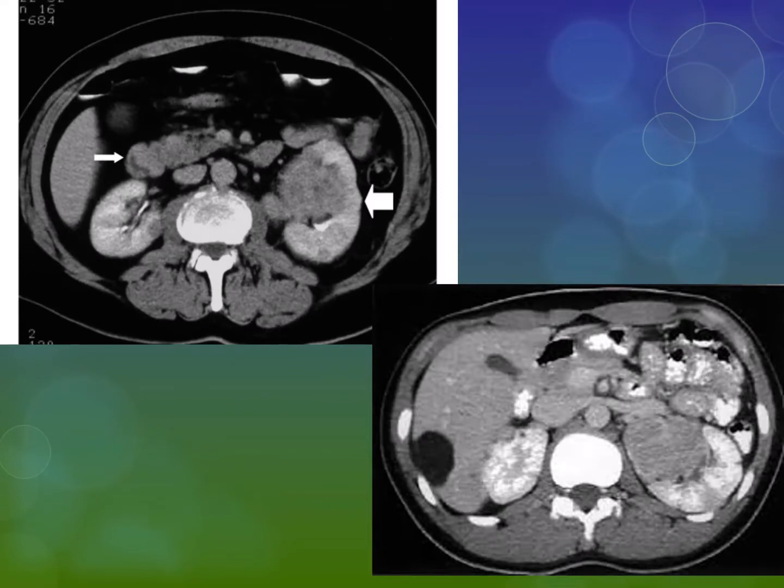So I have 2 more scans here for you. Now this one, there's actually quite a few abnormalities in this one, but I want to focus on the kidney. So once again, here is what is left of the normal kidney tissue, and here is a tumor. And I hope what you're seeing here is this tumor is actually growing outside of the fibrous capsule and some of these may be mets from that. You notice this side looks completely different than this side. Okay, now look down here, same thing. This kidney looking pretty decent, pretty normal.